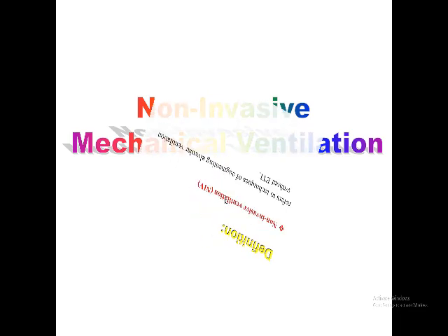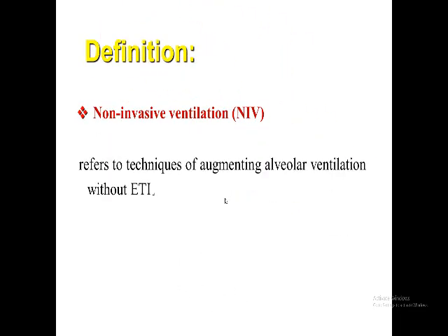Non-invasive mechanical ventilation. When we are talking about non-invasive mechanical ventilation, it refers to technique of augmenting alveolar ventilation without endotracheal intubation. It is the same idea of mechanical ventilation, but without endotracheal intubation.